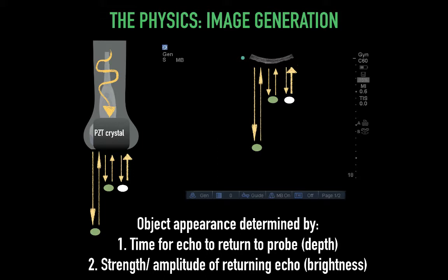The horizontal position of the echo pixel on the screen is based on the receiving piezoelectric crystal's location along the transducer. The resulting horizontal and vertical pattern of the dots' brightness and positioning creates B mode, or brightness mode, often called a 2D image. Waves that are reflected in full and directly back to the transducer will yield the highest amplitude and hence the greatest signal. The strength of the signal in B mode is determined by the amplitude, and the highest amplitude signals get the brightest dots.